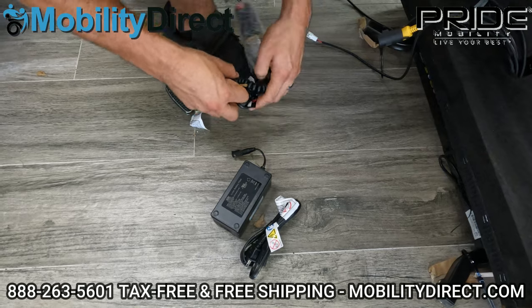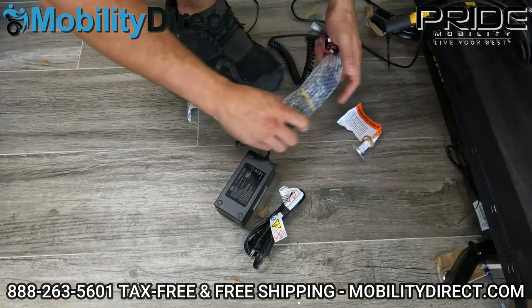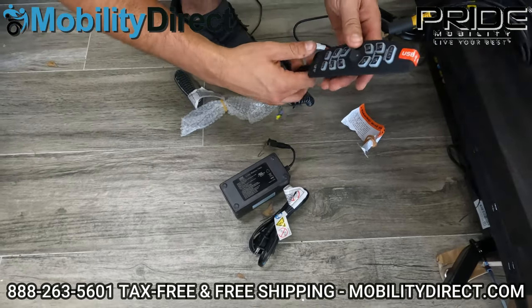Number one, you have the battery backup, the power cable, and your remote control. Make sure you get all this ready for installation. There's a little rubber band around the bag — carefully remove that. Second rubber band around the remote as well.